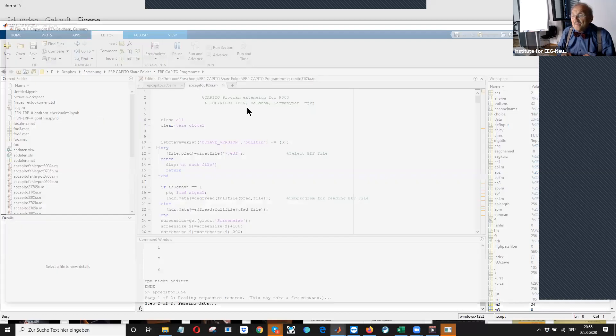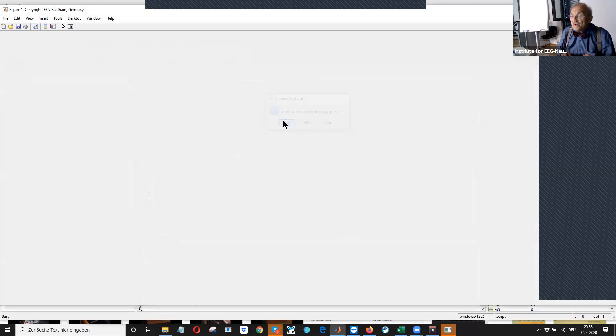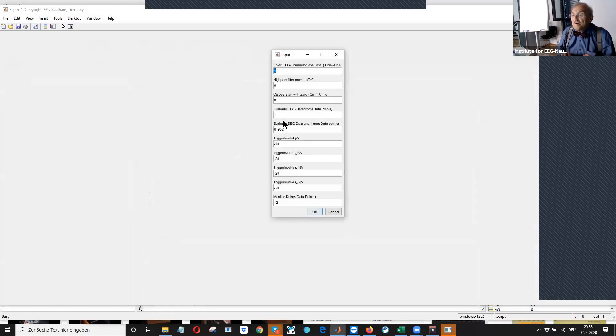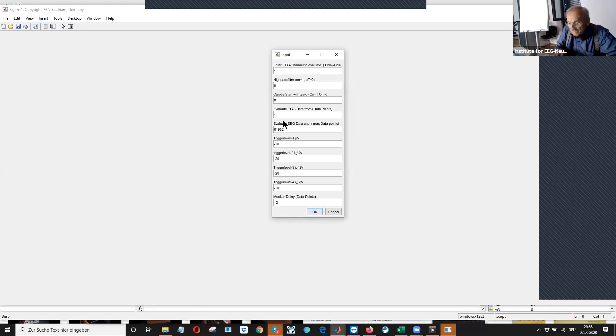We say we want P300 channel 18. Only channel. Okay. And done.